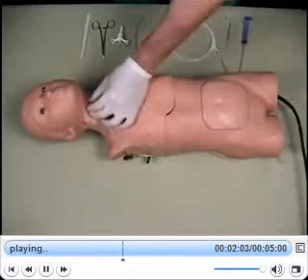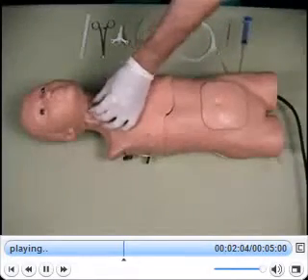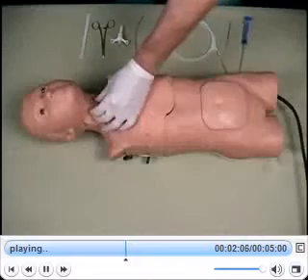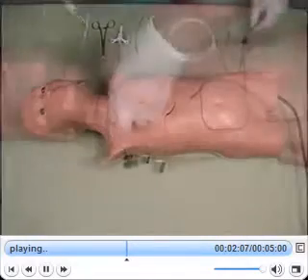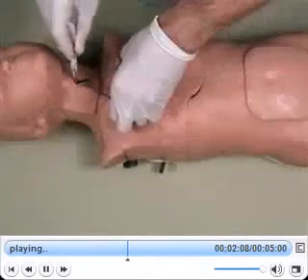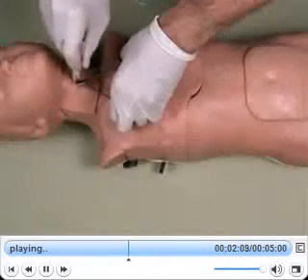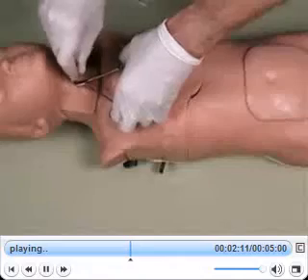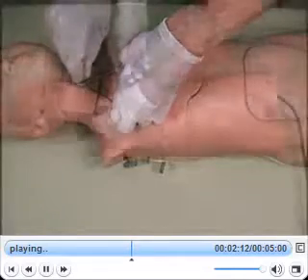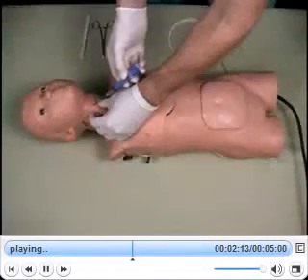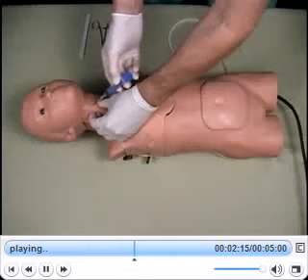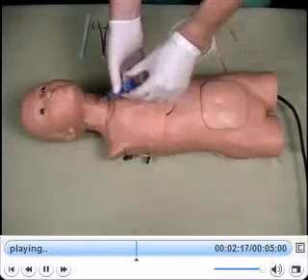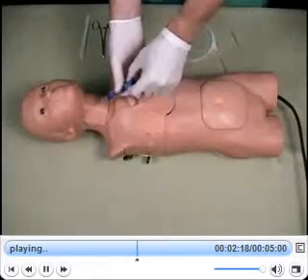Begin by locating the thyroid and cricoid cartilage, which can be palpated through the neck tissue. The system is designed for open or needle cricothyrotomy. Similar to a real procedure, when the cricothyroid membrane is penetrated, there will be an audible pop and a rush of air.